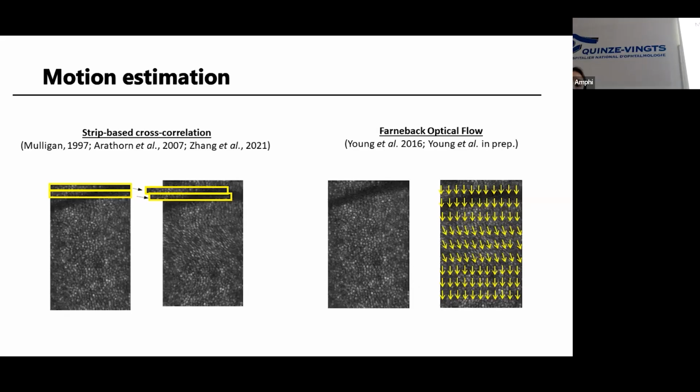You also, when you do this, generate your normalized cross correlation, and the size of the peak of that normalized cross correlation tells you how good the match is. So you have a metric that you can use to reject bad data. Now, what I'm going to talk about now, I haven't done any of that rejection. That's another parameter that I will be testing.